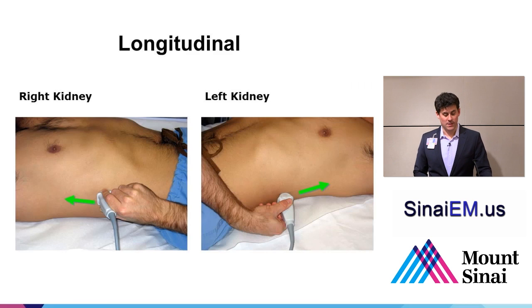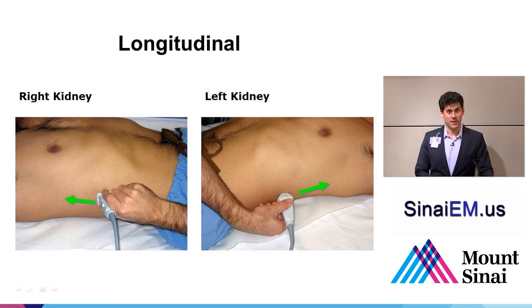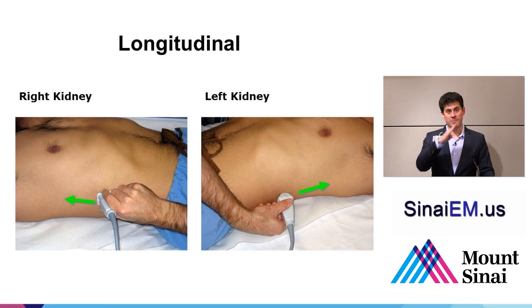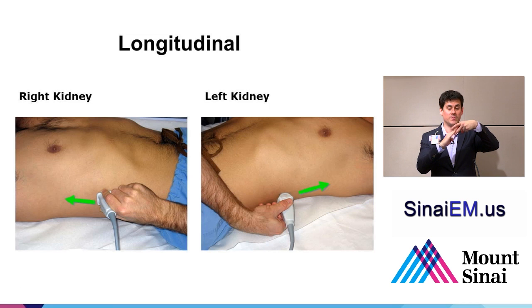Starting in the longitudinal view on the right side, we want to be around the mid-axillary line, with leeway between the anterior and posterior axillary lines. You're going to look in between the ribs, just above the costal margin, with the probe marker facing up towards the patient's head. The left kidney is a bit more posterior — hold the probe with your knuckles touching the patient's bed, positioned a little more towards the patient's head, with the probe angled slightly towards the back of the bed. This places your beam more parallel to the ribs, getting more ultrasound energy penetrating between the ribs instead of being obscured by them.